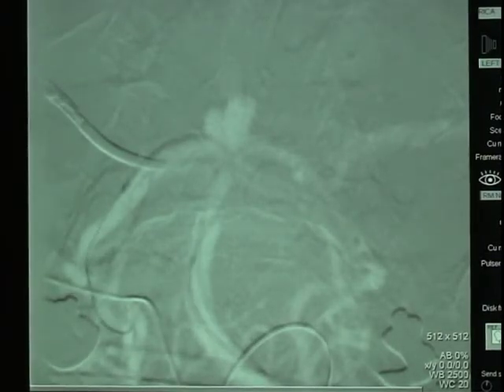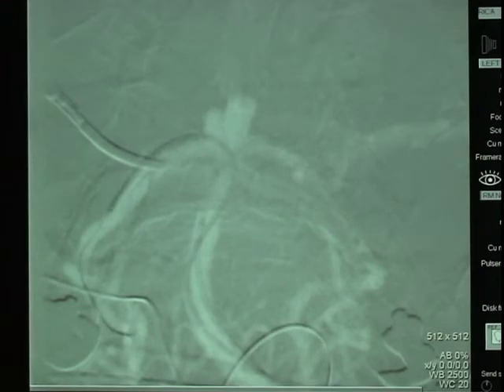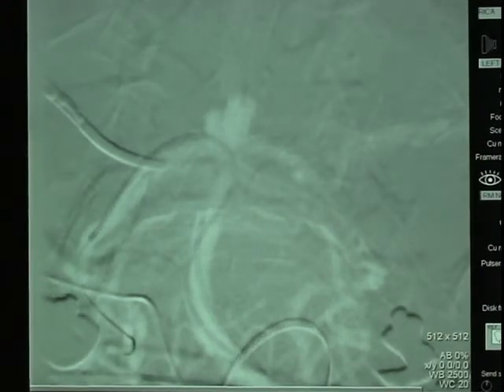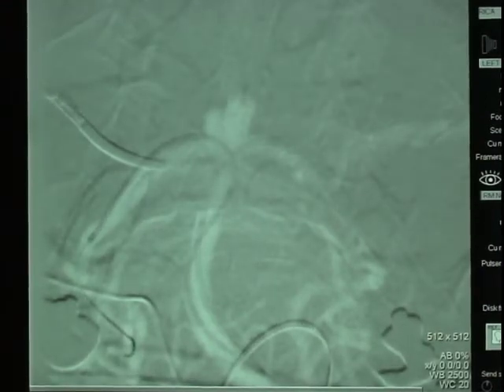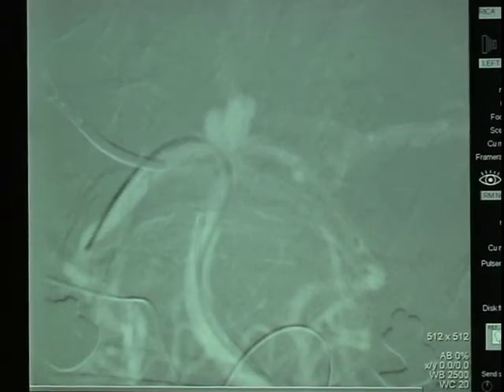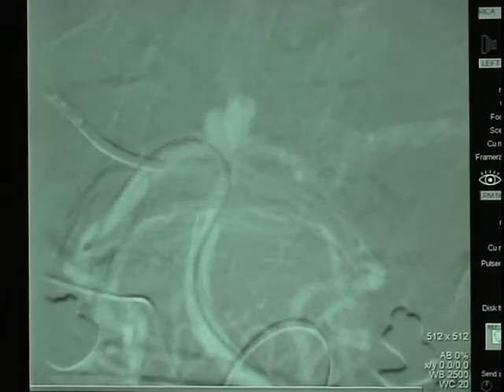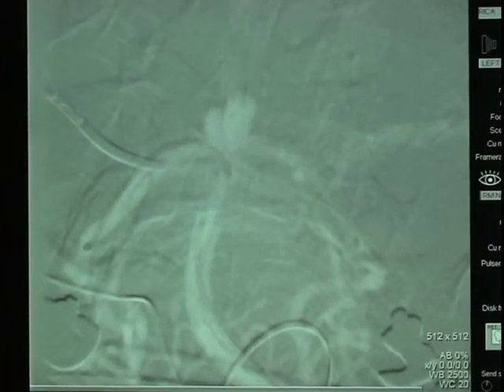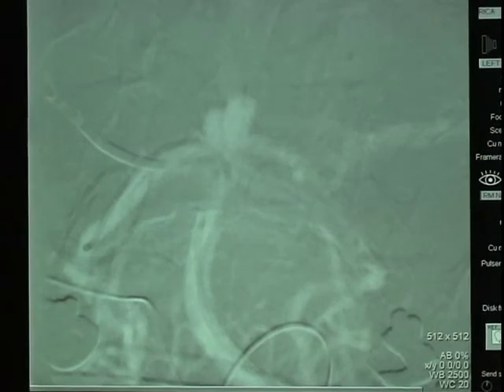We now have two catheters in the basilar artery — one of which extends into the left posterior cerebral artery and the other of which extends into the right posterior cerebral artery.